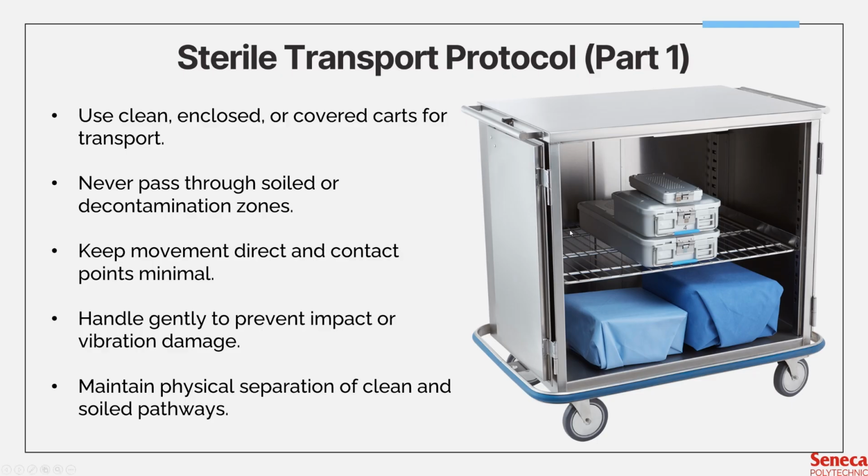Of course, you have to handle containers gently. Rough handling or vibration can damage filters, loosen seals, and even damage the instruments themselves, especially fragile ones. You always maintain physical separation between clean and dirty pathways. Like I said, never go through soiled or decontamination zones. Avoid high traffic areas, areas meant for visitors or patients. You should not be using that. A lot of hospitals will have a dedicated elevator just for OR case carts.